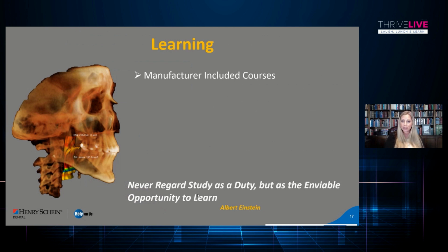We do find that only 60% of dentists actually go back and take the free courses that the manufacturer offers. And I would say that number should really be 100% because we are looking at a totally new technology. We are not born knowing this. And this is a fantastic offering from the manufacturer to provide you with a free course to tell you how to use your machine and help you understand what it is you're seeing.